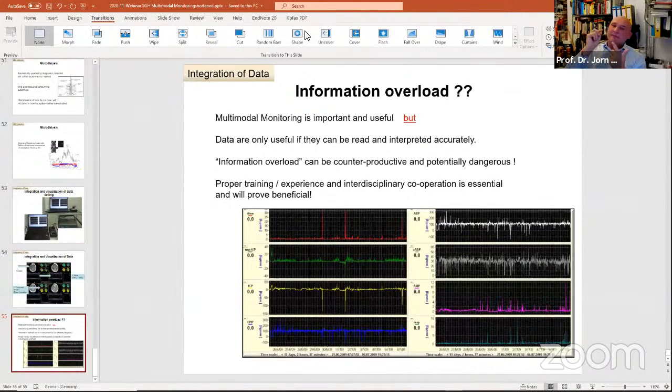The thing is that you don't put an ICP probe in a patient who's awake. So you would not measure PO2 or ICP in a patient who's awake. Sometimes a patient has recovered after being unconscious, intubated and ventilated, and they still have the probe in, and then the ICP can go up. They call you and say the patient's getting worse, what should we do? And you say, well, the patient is awake, talking with you, and the ICP is up. So what's the point? You don't do anything, of course.